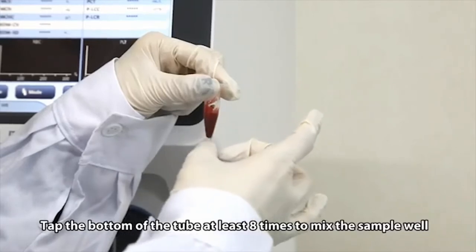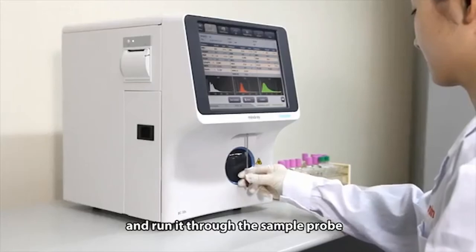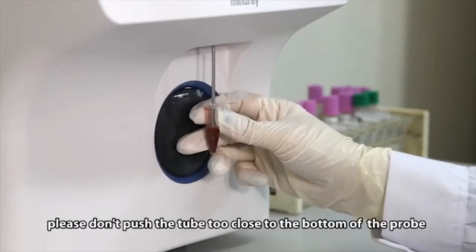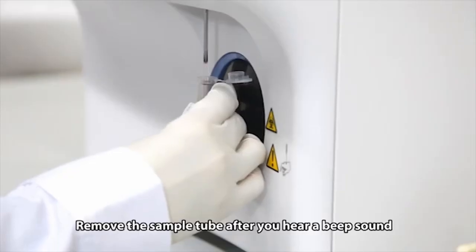Tap the bottom of the tube at least 8 times to mix the sample well, and run it through the sample probe. To prevent blood blockage, please don't push the tube too close to the bottom of the probe. Remove the sample tube after you hear a beep sound.